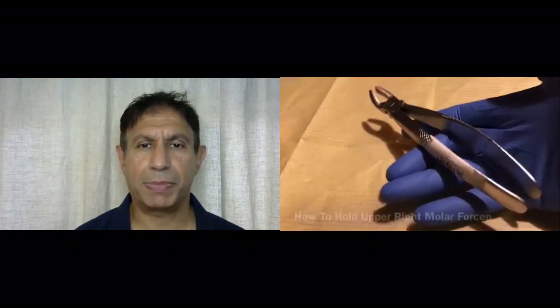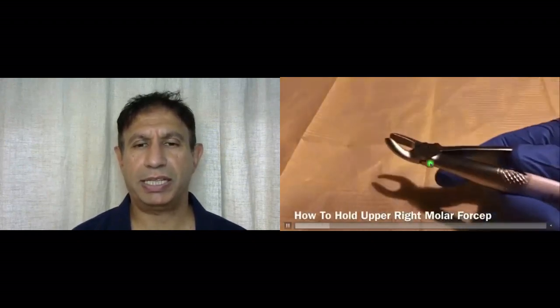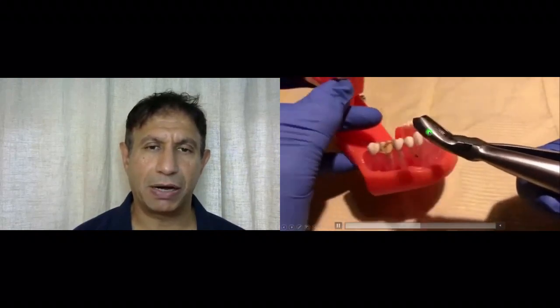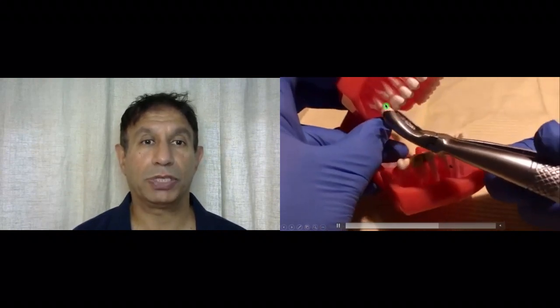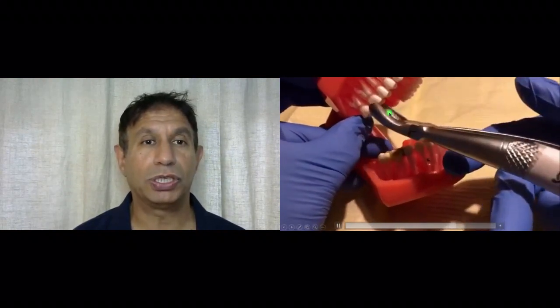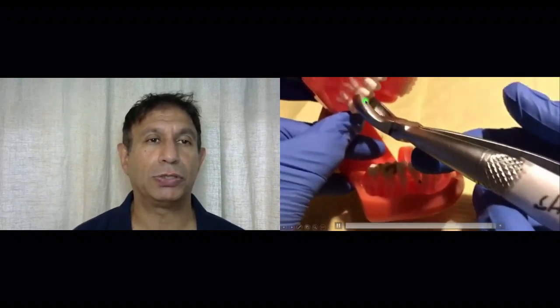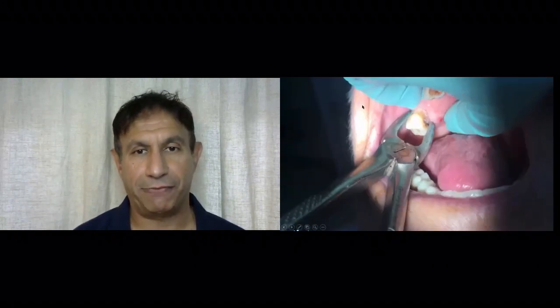Let us summarize this with a video. You can see that the forceps are held in the palm of the hand, beaks are facing upwards. This is the pointy end of the beak, that's a rounded end. The pointy end goes toward the cheek side where you can see the 2 roots. The rounded end goes to the roof side. Beaks are parallel to the long axis of the tooth, and that is the upper right-sided forceps.